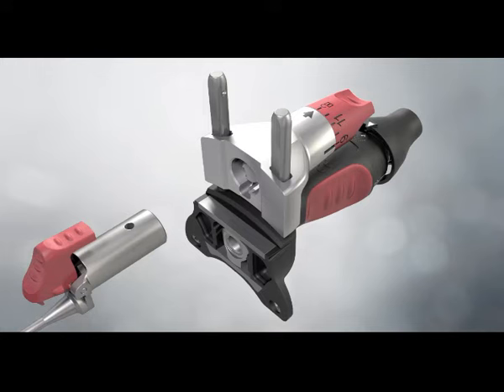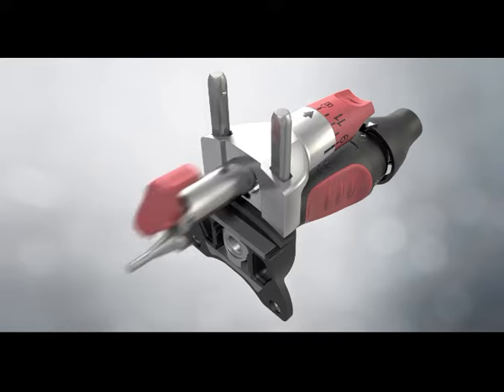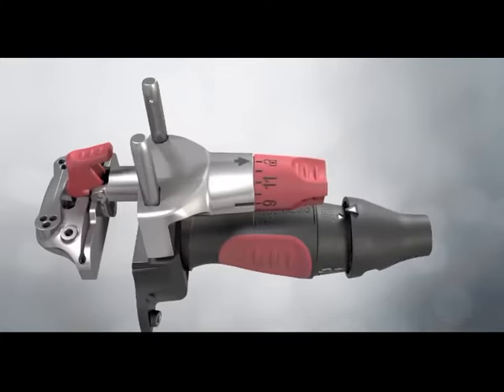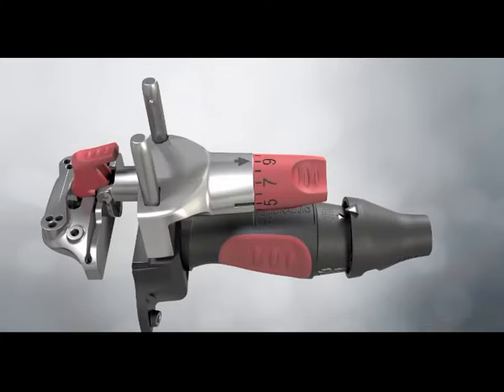With the padlock symbol on the resection knob aligned with the arrow, the outrigger slide is inserted into the outrigger. The distal femoral cutting block is engaged. The resection knob rotates clockwise to set the desired resection level. A 9mm resection will match the thickness of the implant. The arrow on the outrigger indicates the resection level when using the cutting slot. Each click moves the cutting block 1mm proximal or distal.